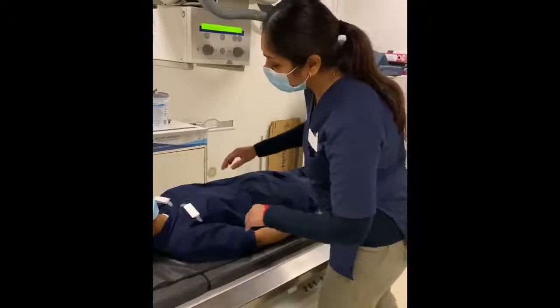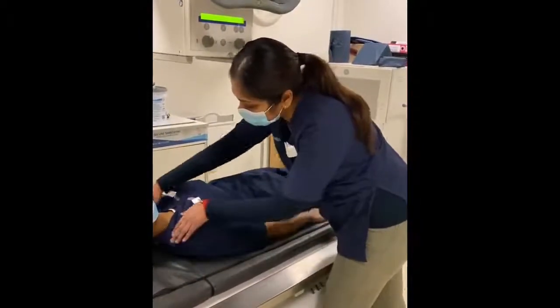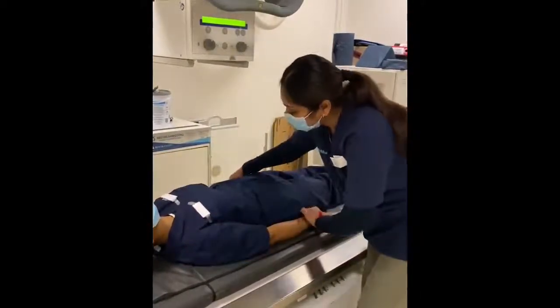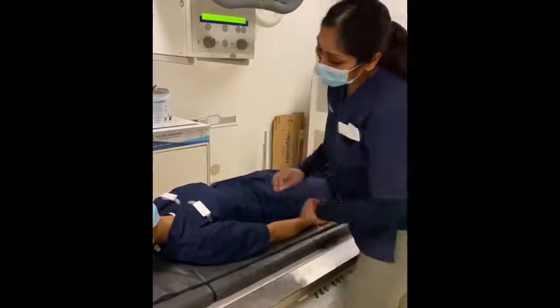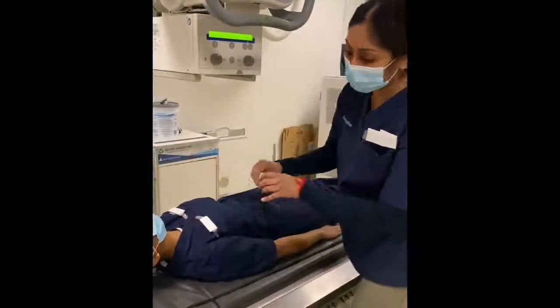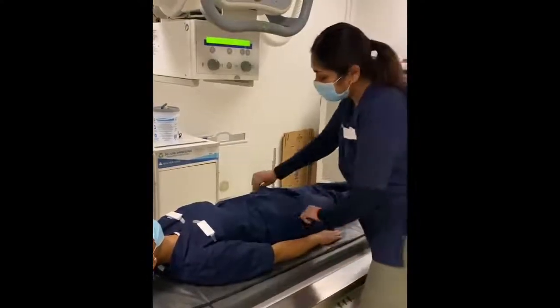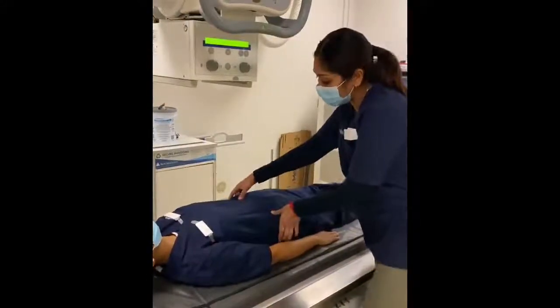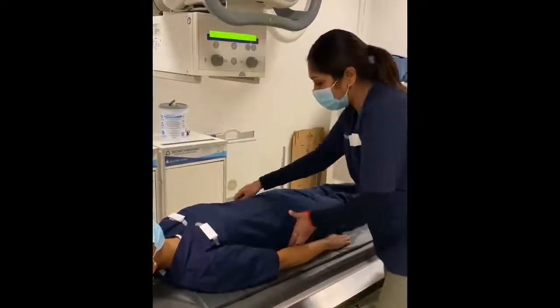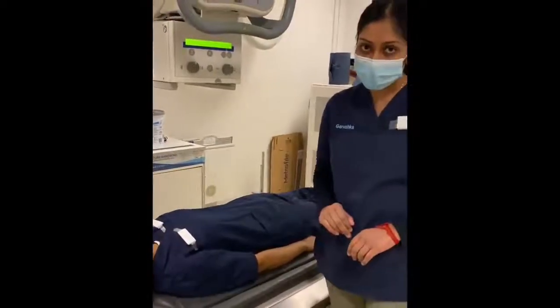Then we're going to make sure that the arms are nicely rested at the side of the patient. Ask your patient to relax their shoulders and put their arms down at the side. That will allow the sternoclavicular joints to be nicely evened out on either side. We come down to the patient's hips. We need to make sure that there's no rotation. Adjust your patient accordingly, and that will ensure that your patient is nice and straight.